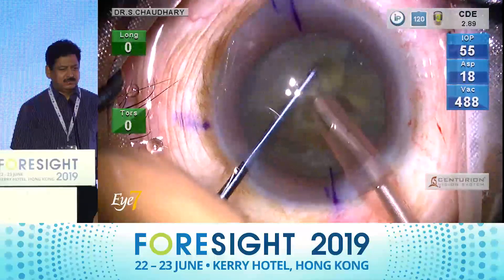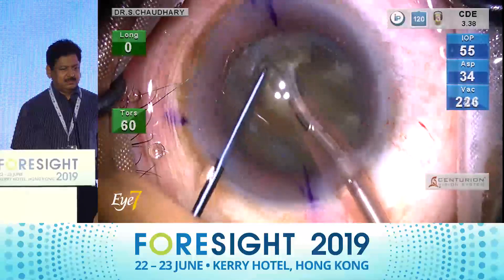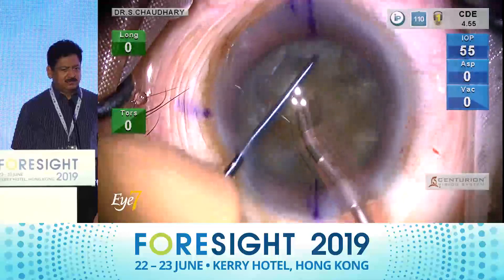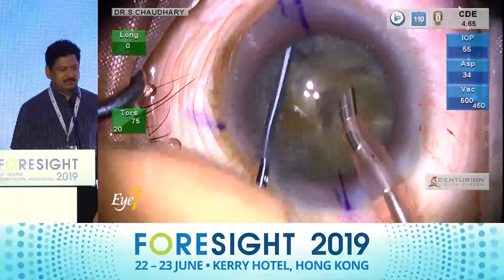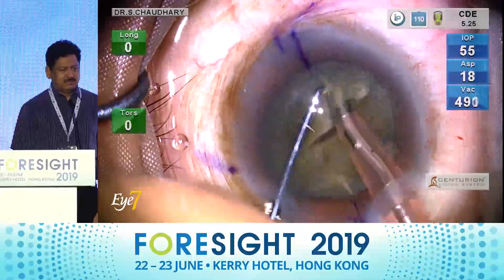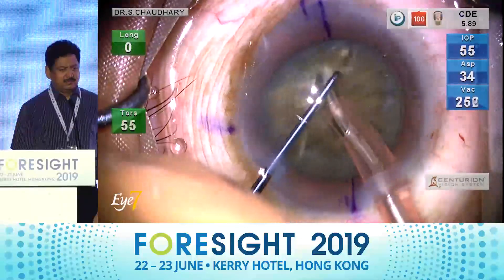An example of what could happen if I don't use longitudinal phaco for my chops: notice, I am holding the nuclear piece and then there is a slip. I am again holding a nuclear piece, but because of the torsional or side-to-side movement of the phaco tip, the nucleus gets emulsified at the tip and I lose my grip. In a third situation I am able to get my grip and do my chop, but in the fourth chop I again lose my grip.